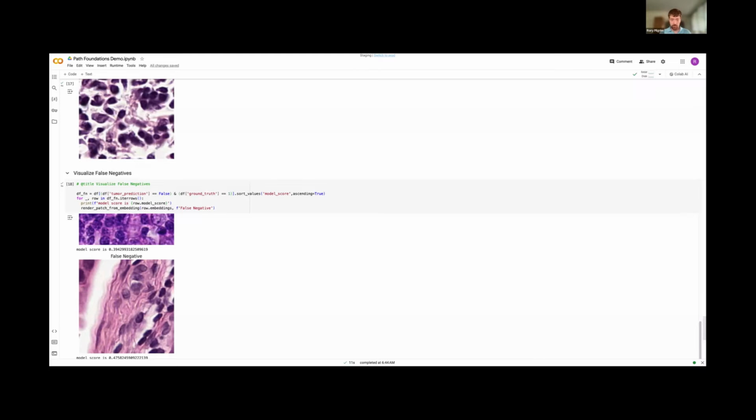And then whenever we see a new embedding, we say, I'm just going to multiply each of my 384 features by the corresponding weight, add them all together, and that's my score. And that's the score you saw beforehand. So that's how we actually calculate these scores here.